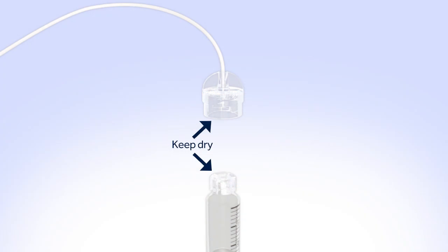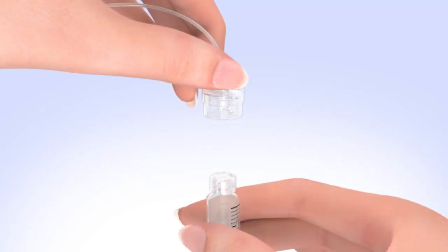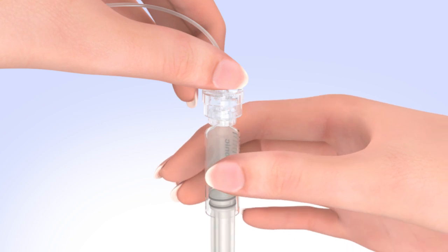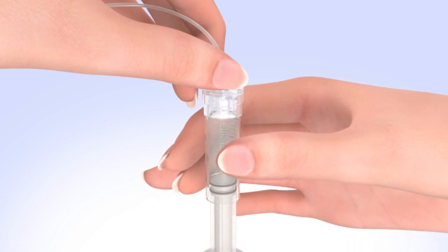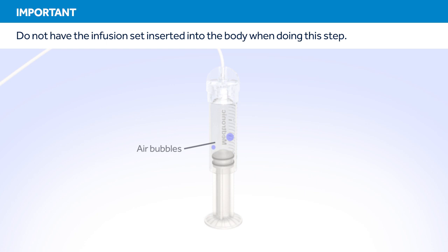Make sure both the top of the reservoir and the inside of the tubing connector are dry before connecting them. Liquid can temporarily block the vents on the tubing connector, which may result in delivery of too little or too much insulin, causing hyperglycemia or hypoglycemia. If any liquid has gotten on the top of the reservoir or inside the connector, start over with a new reservoir and set. To connect the tubing to the reservoir, hold the tubing by the connector and place it on the top of the reservoir. Find the right position by turning and gently pushing the tubing connector until you feel it slide smoothly in place, then turn clockwise until the reservoir and tubing connector lock with a click. The tubing connector should not be loose. You should not have the set inserted into your body when doing this step.